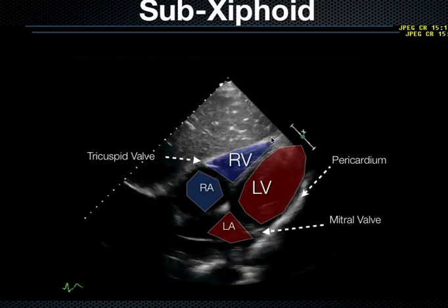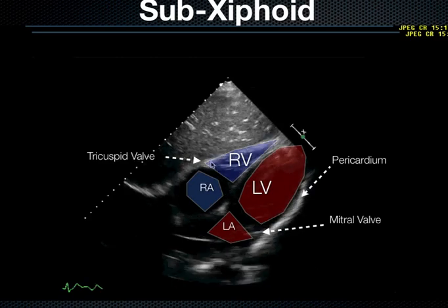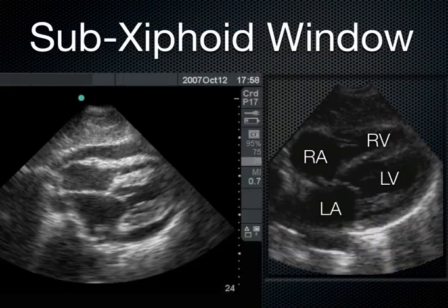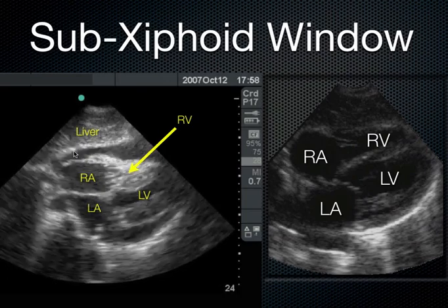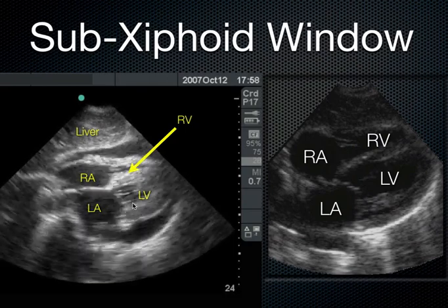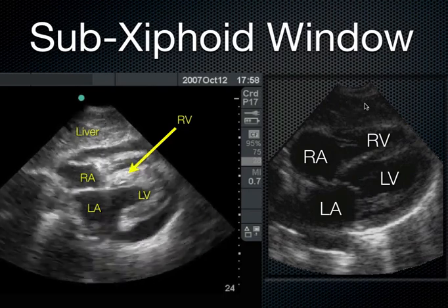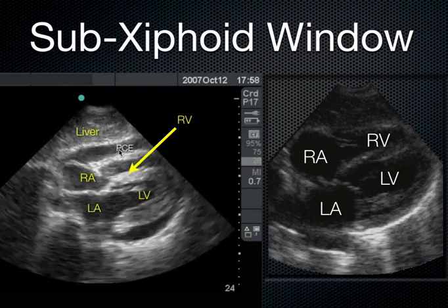You see, in a supine patient or somebody lying flat, the heart is heavy, and it sits in its posterior pericardium, squishing any fluid anteriorly. And so this is exactly where you see these pericardial effusions, right along this anterior area, like we do here. So here we see this pericardium, coming around down here. We see the chambers of the heart in this subxiphoid view or subcostal view. Here's the liver. That's our window to see the heart. And we can make out that this heart has a pericardial effusion.